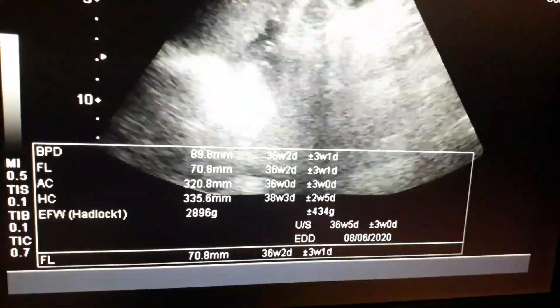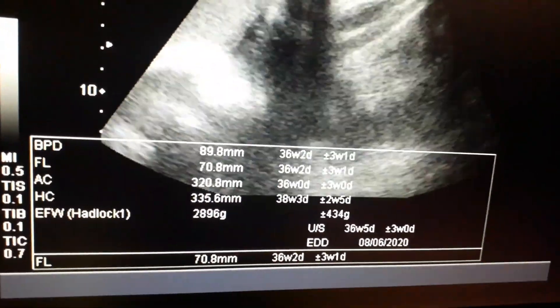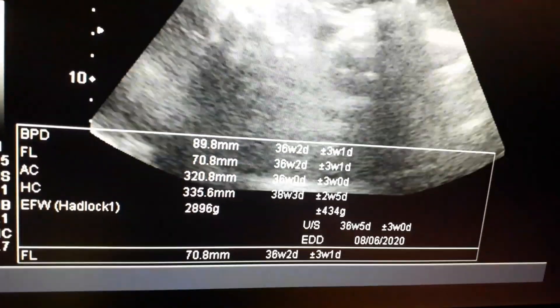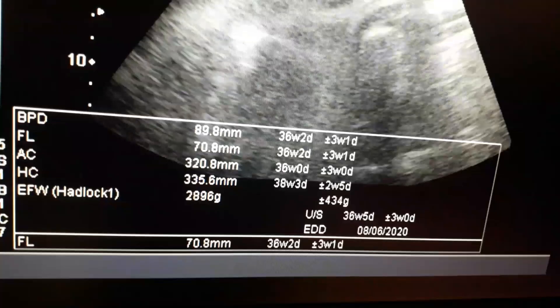At the end I will show you the gender of the baby in the form of the scrotal sac. That is a male baby — the gender is male.